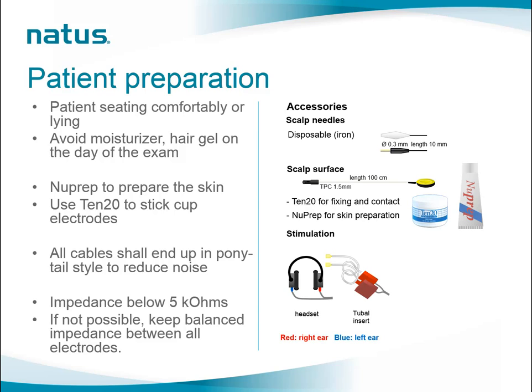When the patient comes in, he should be sitting comfortably in a chair or lying down to make sure he is fully relaxed. If possible, the patient should avoid moisturizer or hair gel on the day of the exam. If he comes in with these products on, you may dissolve, for example, the hair gel with alcohol pads. Just put a little bit of alcohol on the location of the electrodes and leave it on while you prepare your cup electrodes or your needles, and this may dissolve the product.